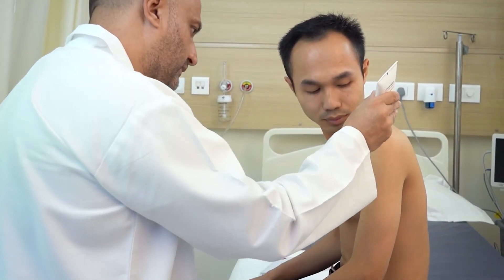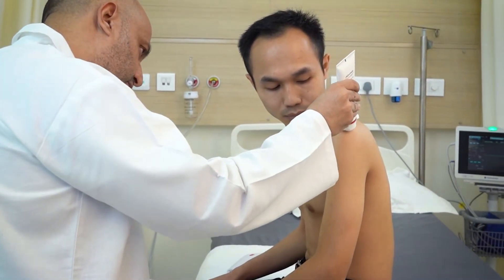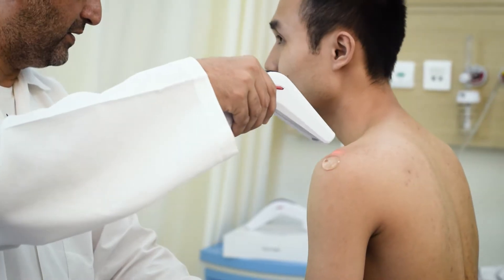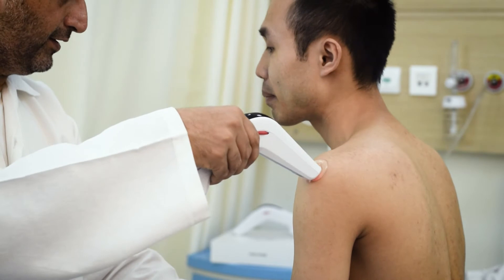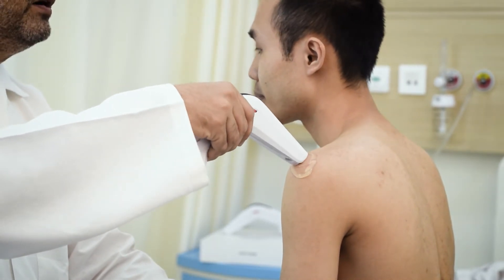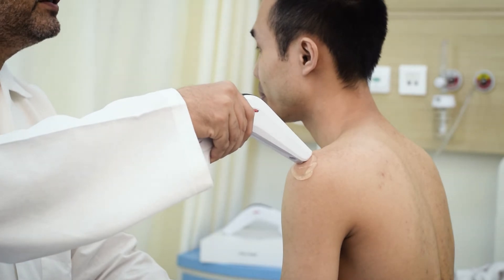Apply a small amount of Cura laser biostimulation gel either on the therapeutic head or over the shoulder. Press the small switch to turn on the small therapeutic head. Hold the Cura laser as demonstrated and place the small therapeutic head in contact with the skin.